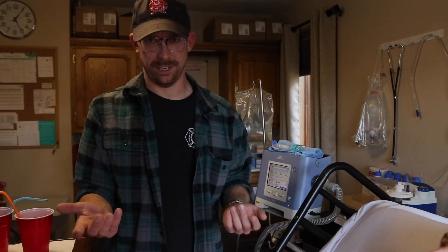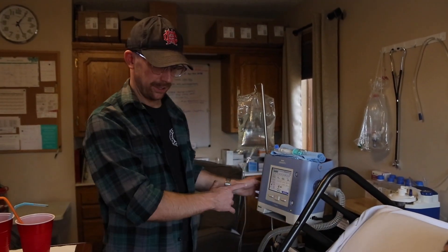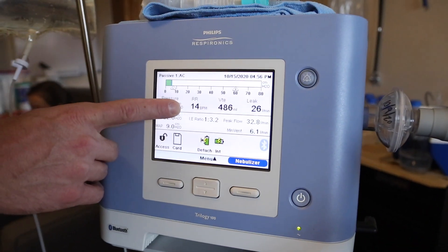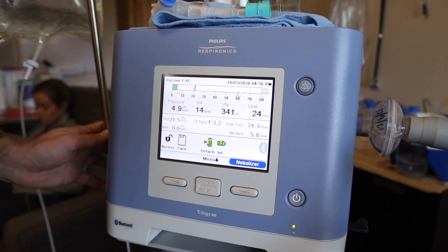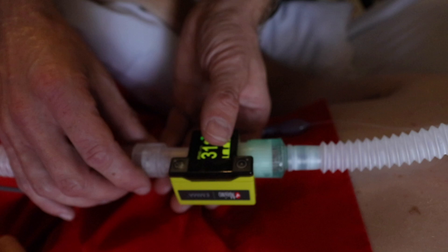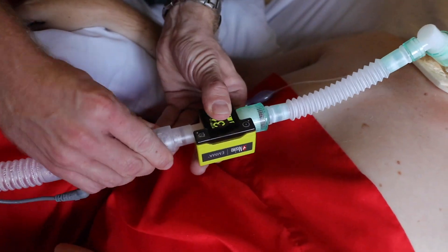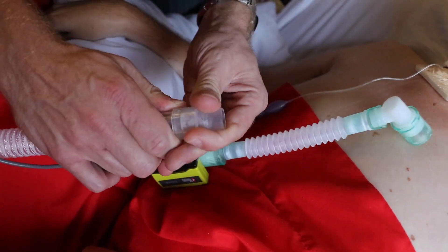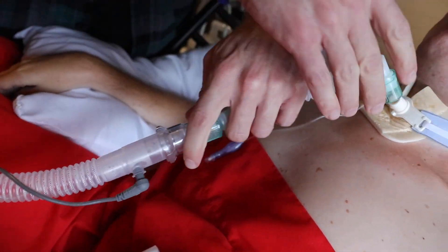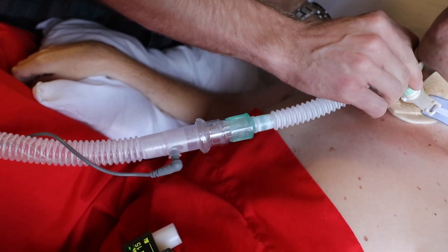Brock is also chronically vented and trached, so his circuit may be different from a patient who was, for example, intubated in the field. You'll also note the respiration numbers here correlate nicely with the numbers on his device — we're at 14 there and 14 on the Emma. We did have to attach an extra adapter in line right here to make the device fit properly.